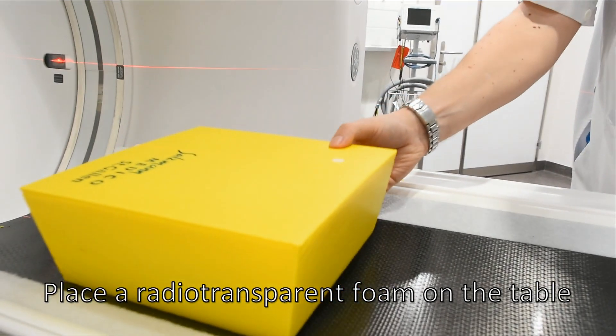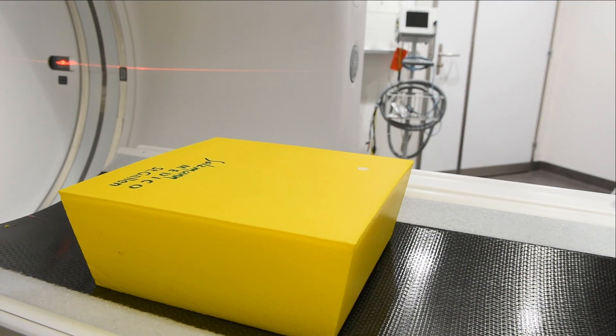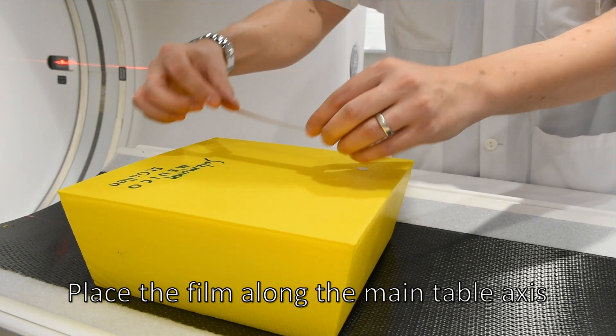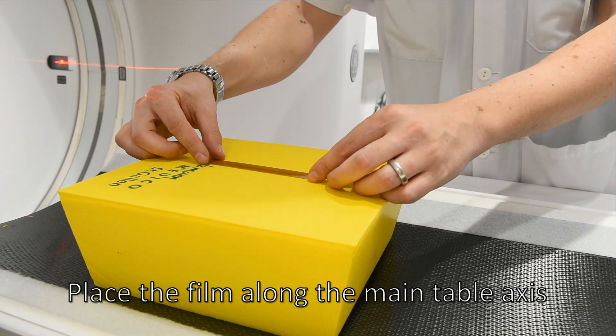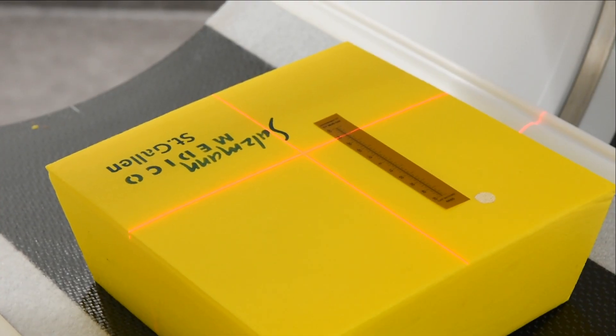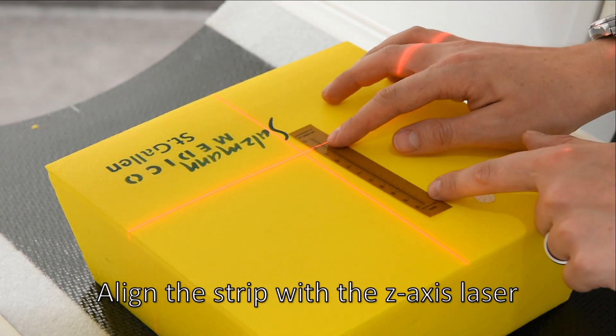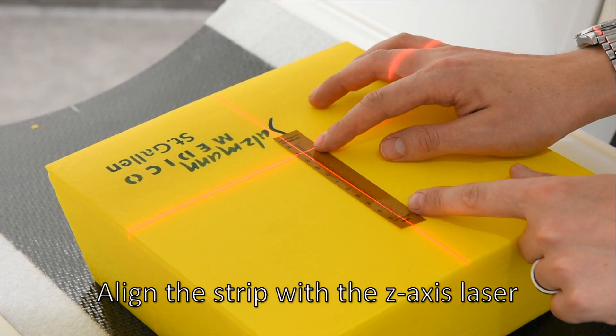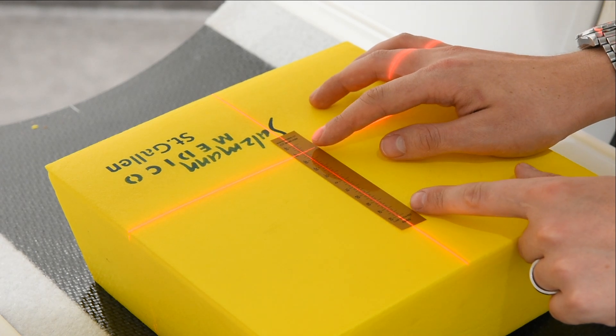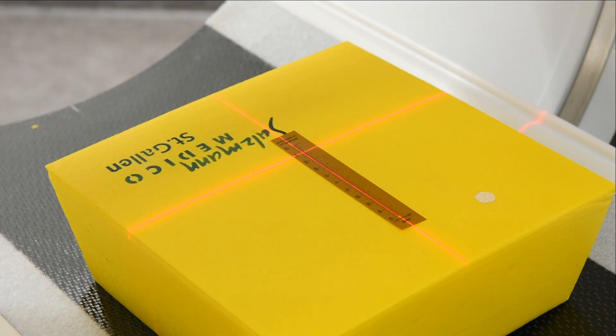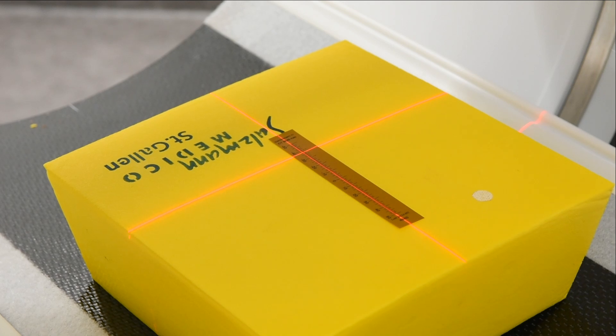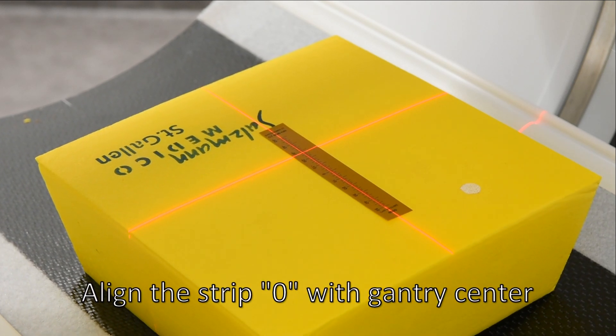Place a radiotransparent foam on the table. Place the film along the main table axis. Align the strip with the Z axis laser. Align the strip zero with gantry center.